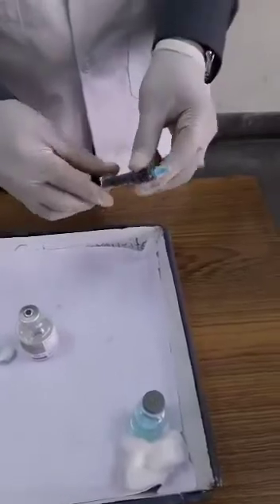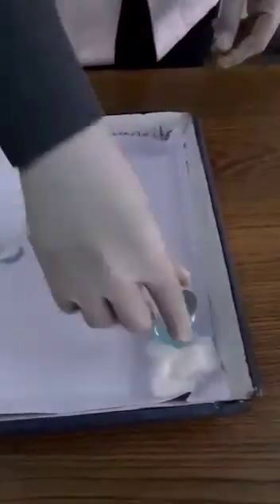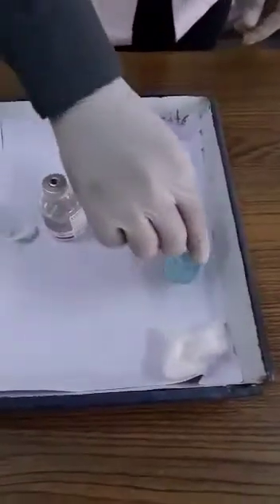We are going to demonstrate how to aspirate a drug from a vial. The materials needed are: a vial with the required drug or solution, a syringe of the appropriate size, a needle of the right size, and disinfectant and cotton wool.